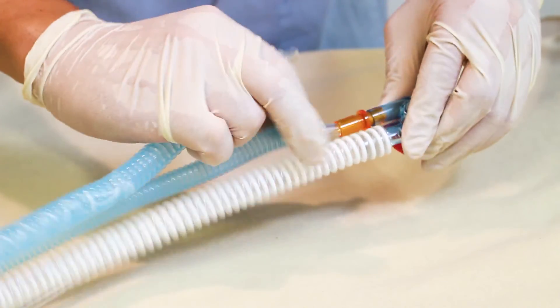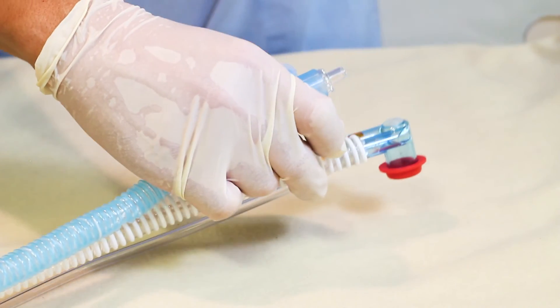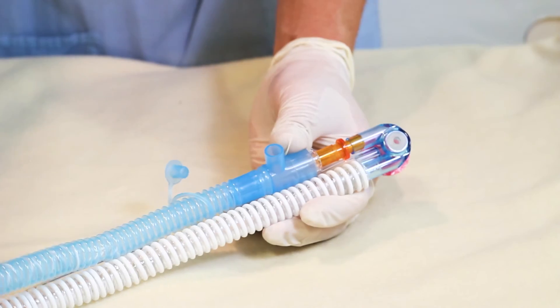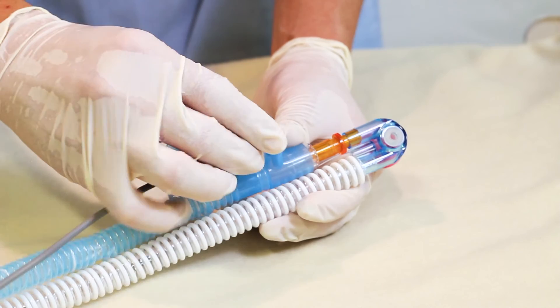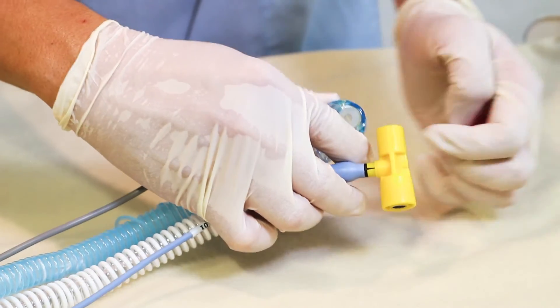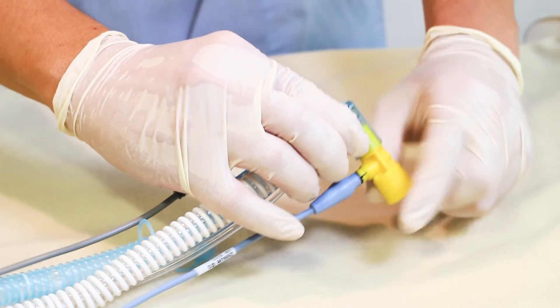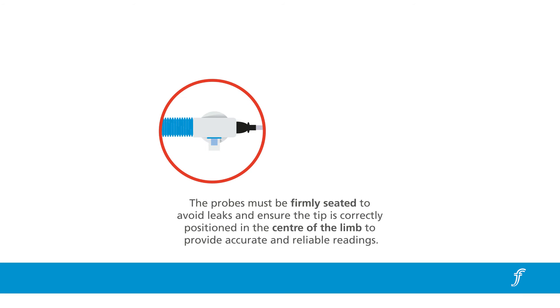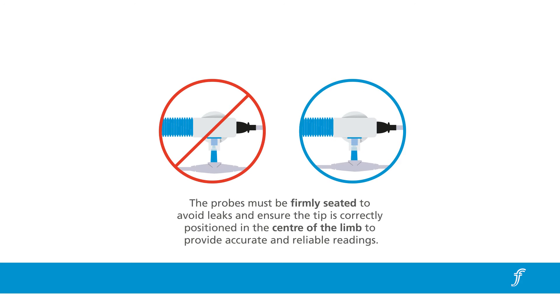If an incubator is not used, remove the incubator extension and attach the inspiratory heated wire limb closer to the patient end Y-piece. The temperature probe is inserted into the sensor port at the patient airway end of the inspiratory limb. Attach the flow sensor to the patient end Y-piece and cap. Check that the probes are firmly seated to avoid leaks and ensure the tip is correctly positioned in the centre of the limb to provide accurate and reliable reading.